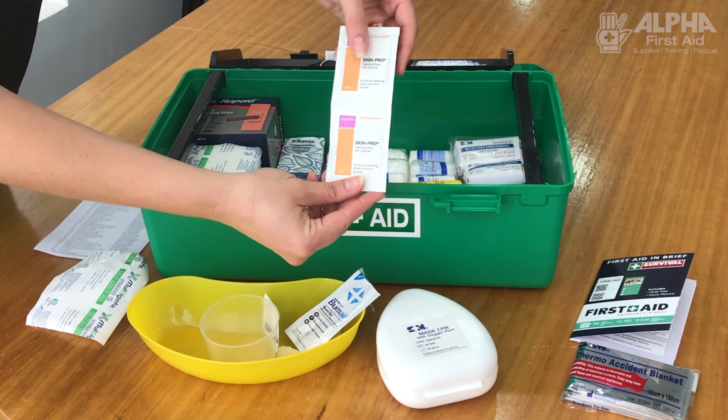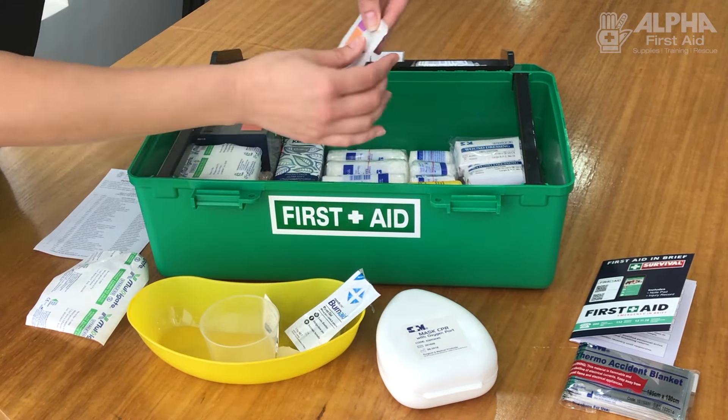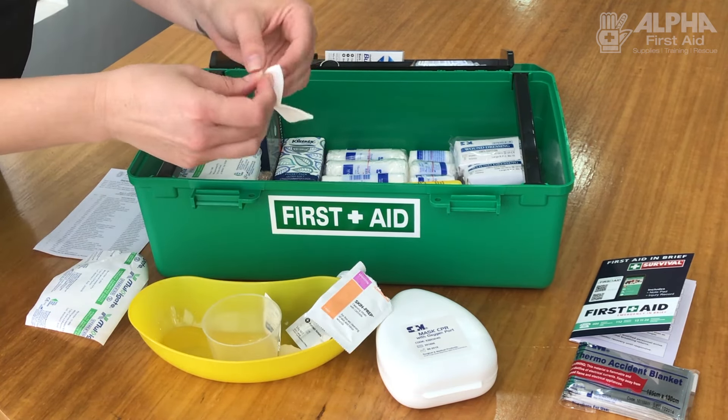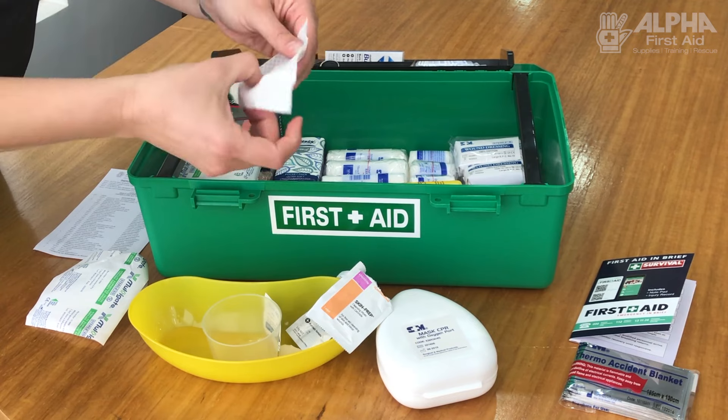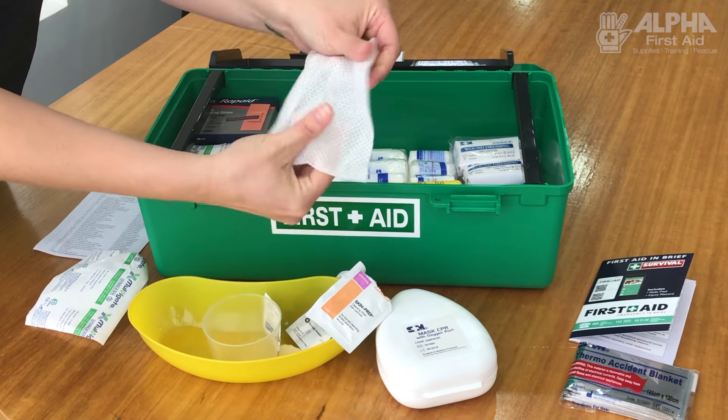These ones are antiseptic wipes, a little bit different from the alco wipes — these are actually meant to wipe the wound. If you've got a small wound, this is probably all that you'll need. It's a slightly larger swab impregnated with antiseptic. They may be called a skin prep, a wound prep, or a wound wipe.